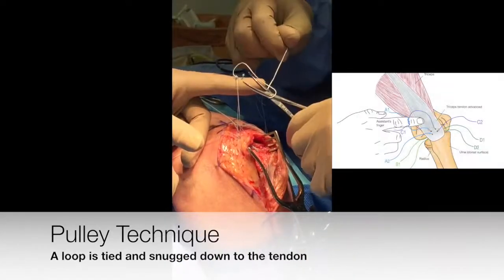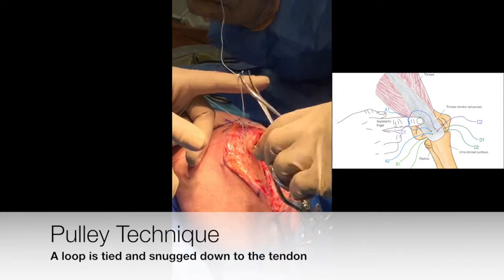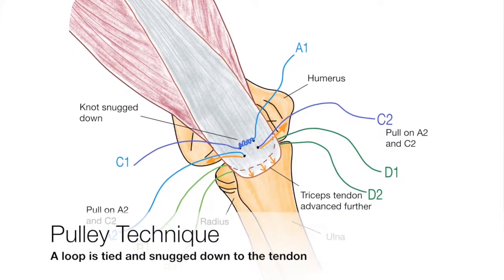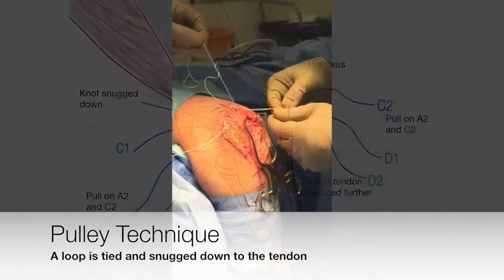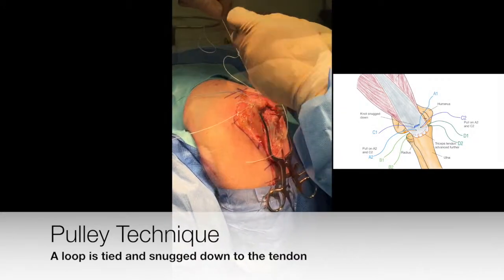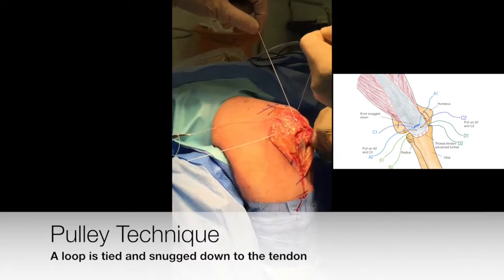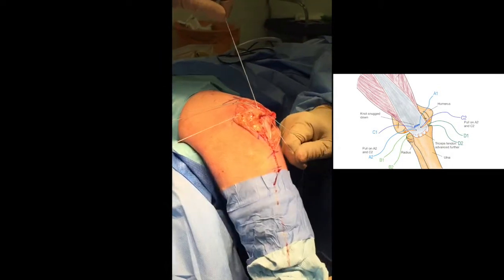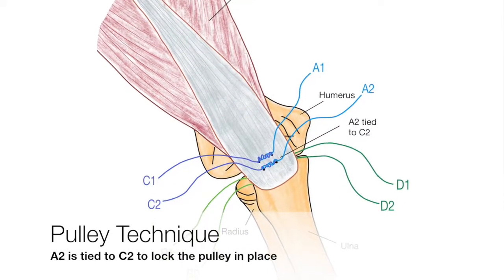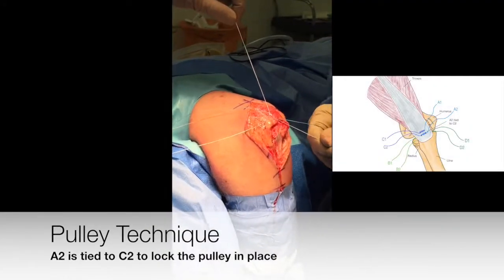A loop is first tied over the assistant's fingers using strands A and C. The other ends of these are then pulled through, snugging the knot down and opposing the triceps to the tendon footprint. The free ends are then tied to lock the pulley in place.